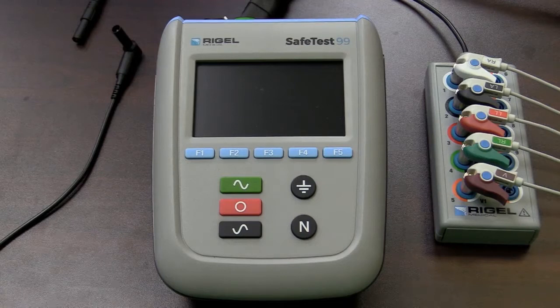The SafeTest 99 allows for safety testing of medical devices that have patient leads. And like the SafeTest 50, it features a universal power supply, so it will test devices operating from 90 volts AC up to 264 volts AC, increasing the flexibility of the testing within the lab.